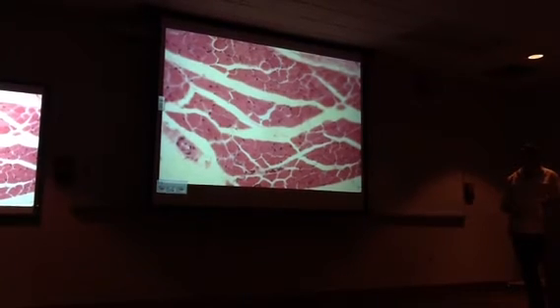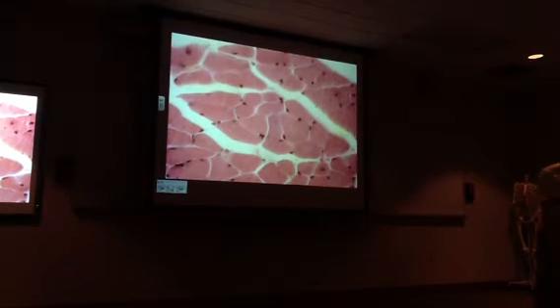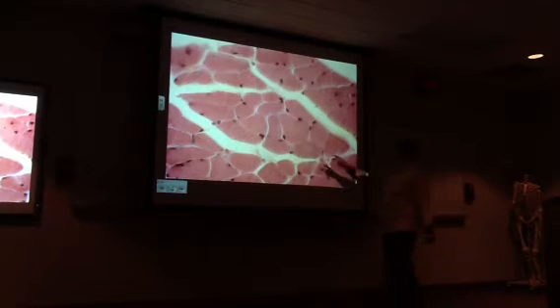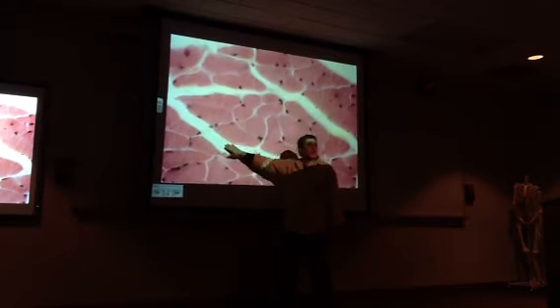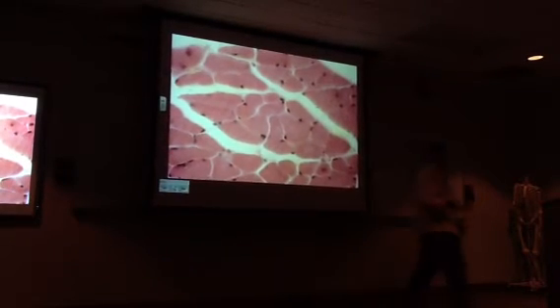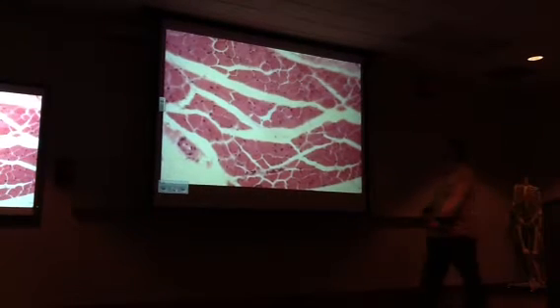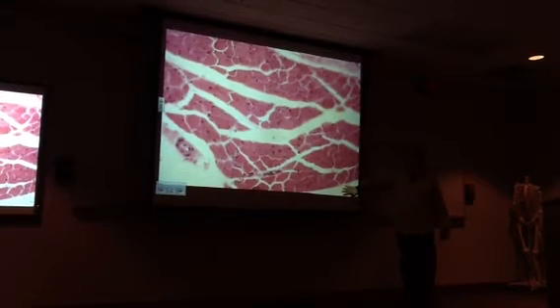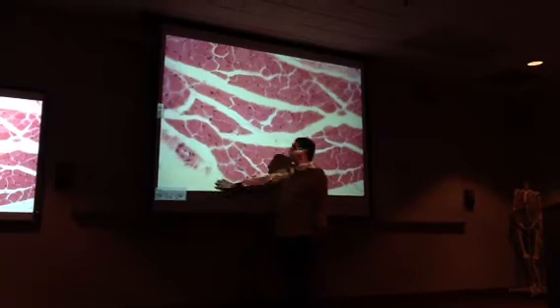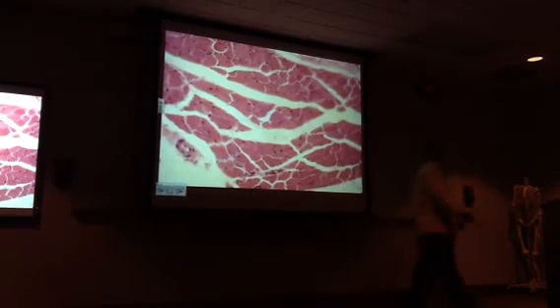Not the best micrograph, because it's almost very refractile and maybe artificially separated. But I think there's no question you can say these areas would be endomysium, and maybe this is perimysium around it. Again, I don't know where epimysium is in relation to that. Even here, I don't know with absolute certainty where the edge of the section is. You might imagine if you had some of the connective tissue here or here, you might be on epimysium, but there's not enough information on that slide.